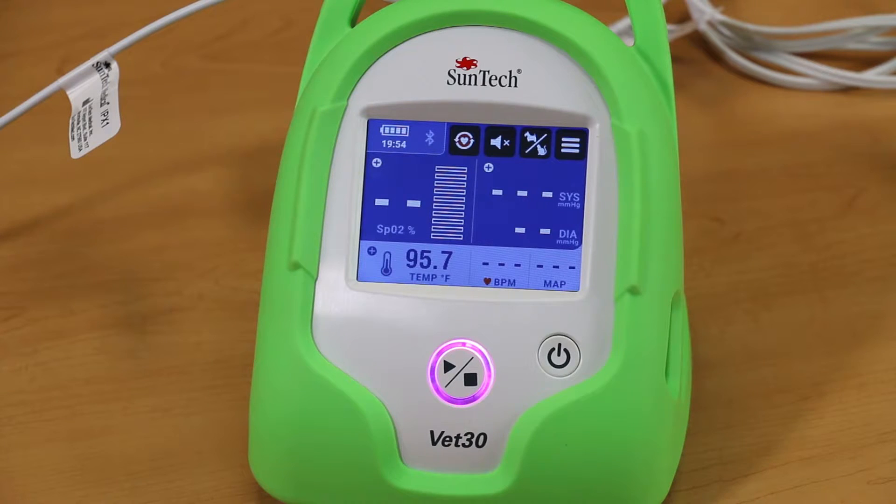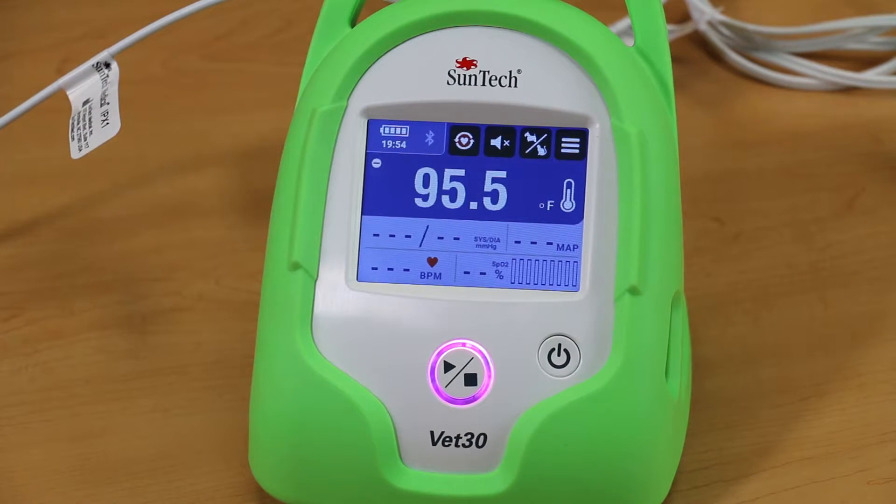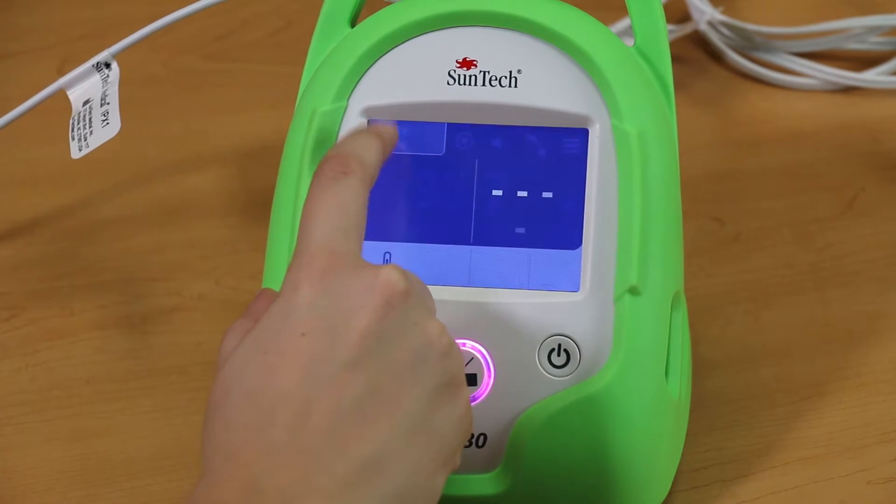To change the display to show the temperature focus screen, press the plus button in the upper left-hand corner of the temperature section on the main screen. The focus screen shows a larger view of a key parameter.